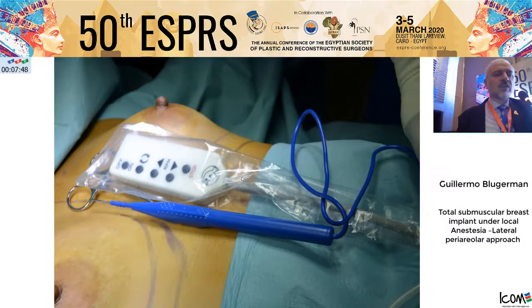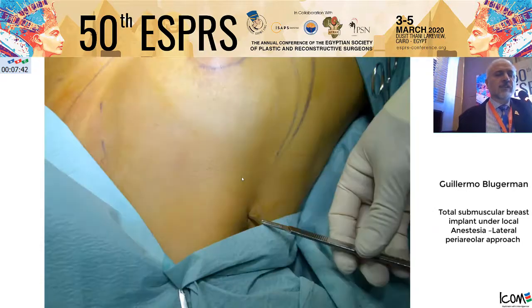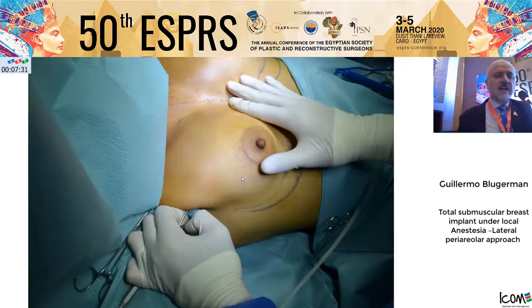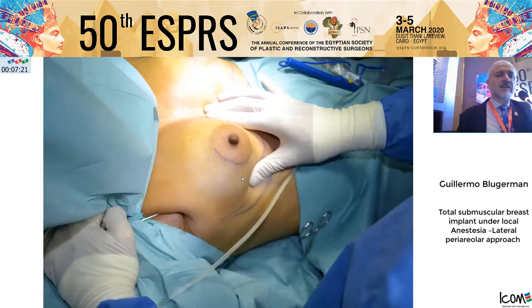We have the remote control in our hands for our pump and start infiltration in the posterior border of the pectoralis in the axilla. With a small incision, we use a special 3.5 mm cannula, very strong, to elevate the muscle and allow us to go in a fan motion all around the breast.